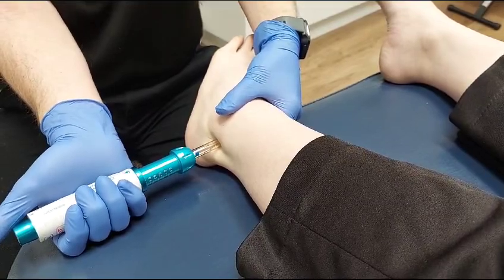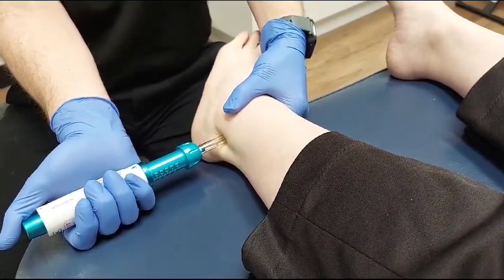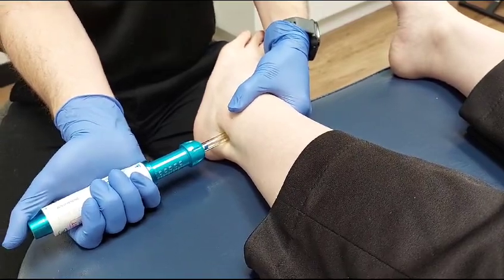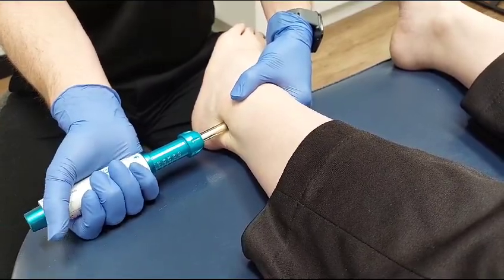Holding this very firmly — you can see there's some good indentation there. We're going to depress, so it will squirt the liquid out using the spring. I call this my 'bumper' because that's essentially what it does. Ready? One, two, three — firm pressure, and then you hold.